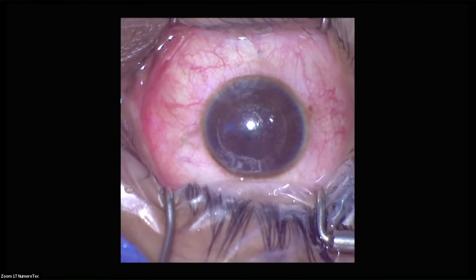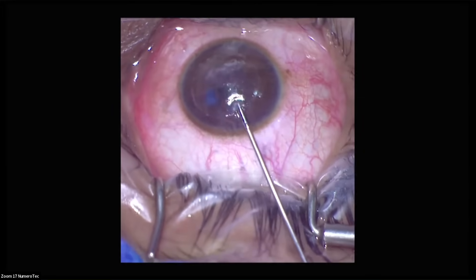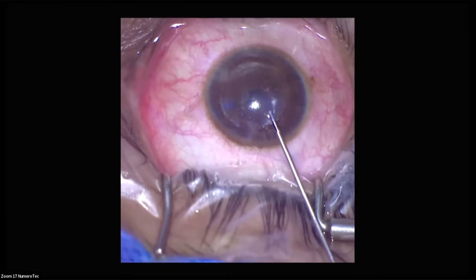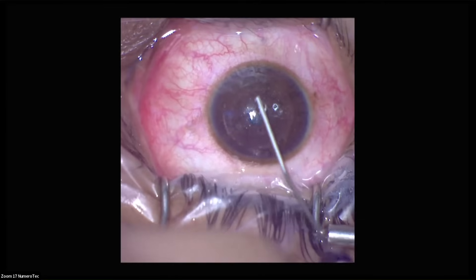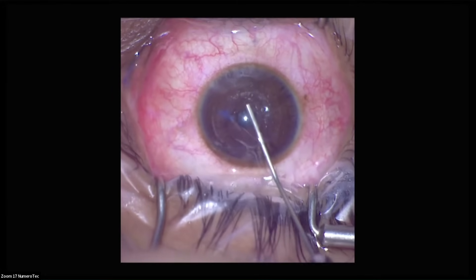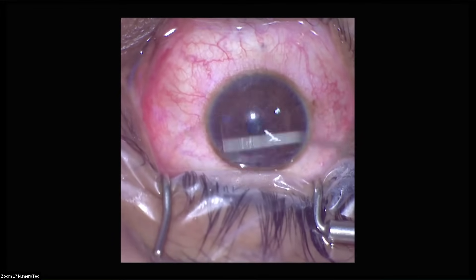That's it. Excellent demonstration. Now I'm going to put a small bit of saline here and irrigate the interface to wash out any debris that might be impacted inside. A few gentle sweeps will bring out any foreign bodies or material inside the interface.